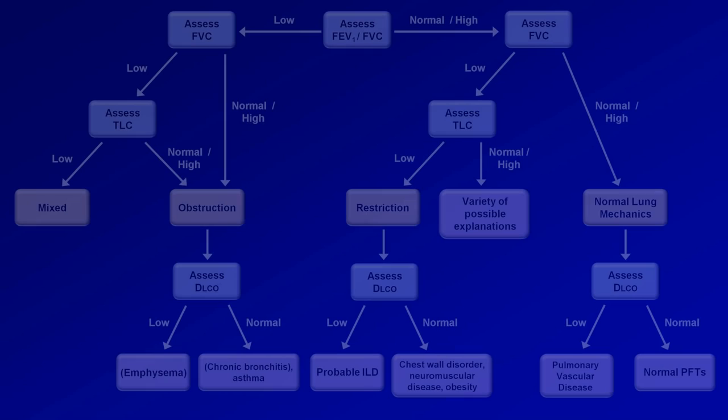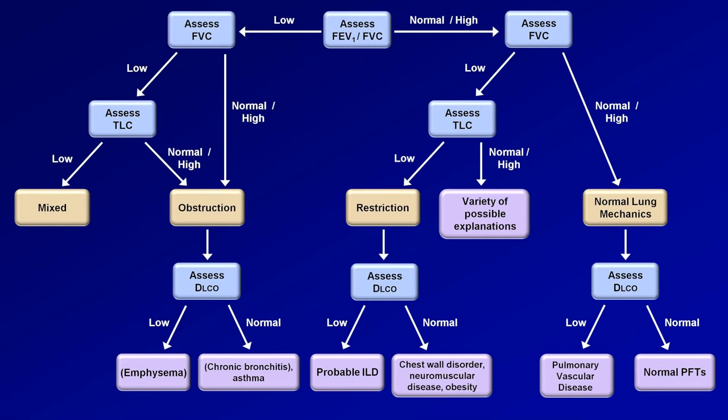And finally, the last slide of this review is this more comprehensive algorithm for using PFTs in the diagnosis of chronic lung disease. I will not review the details, but feel free to pause this and copy it down, because if there's only one image to remember from this whole video series, it's probably this one. The one thing I will discuss in this chart is this distinction down here.